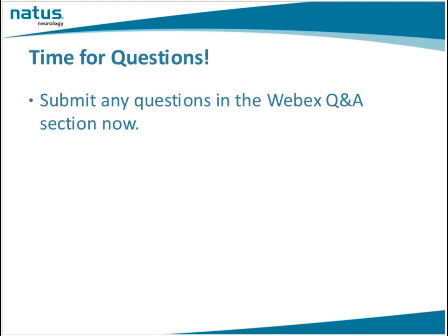Ann, can I just ask for clarification there? You may not know this since that wasn't a big focus of the STOP study, but in adults, we consider a normal pulsatility index to be 0.8 to about 1.2. Was that applicable in your children? We would usually just use 1.0 as our normal PI, and anything below that we would be a little suspect. But like I said, we just didn't use it that much as a basis.